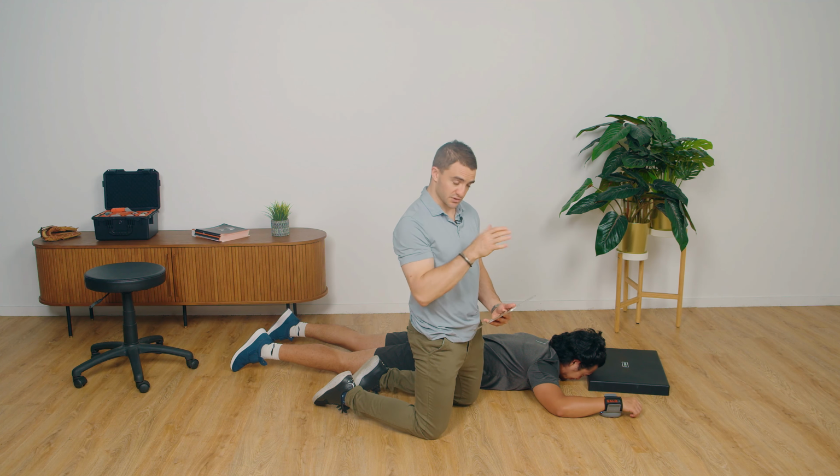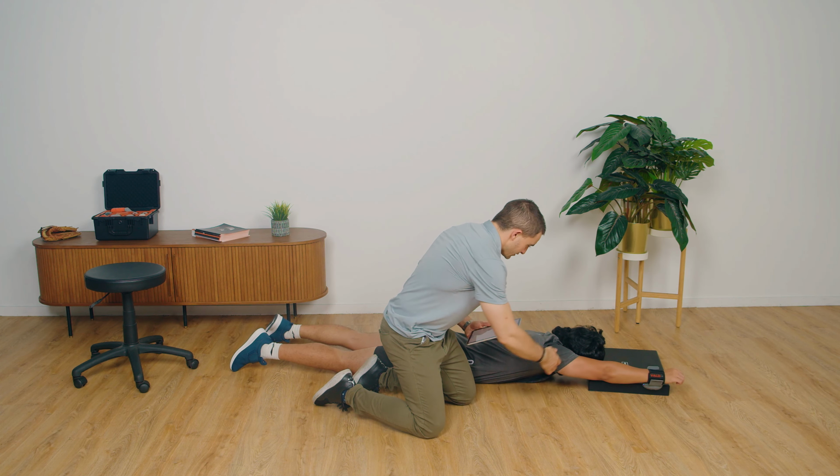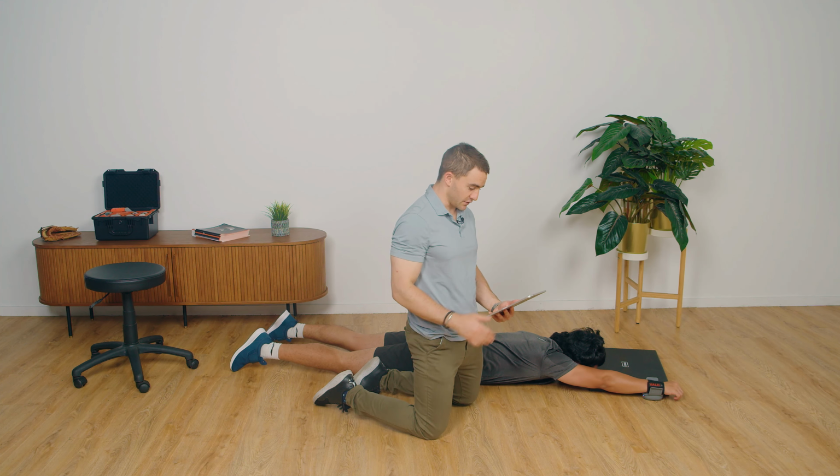Now, like all the other tests we've performed, anything that we normally do for the uninvolved side, we'll perform for the involved side, but just for the purposes of this prac, we'll stick to one side. So we'll start on the right side, get Cal into position, so arms straight up overhead, 180 degrees, making sure that the other hand, if you can't see it, is down at his side for the I position.